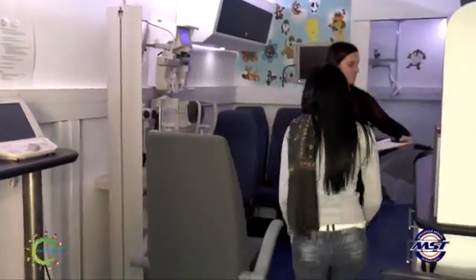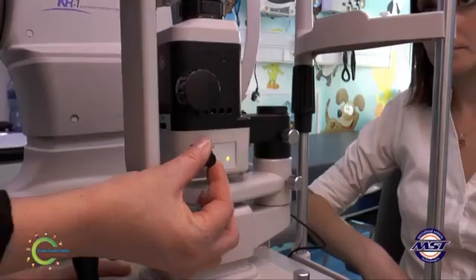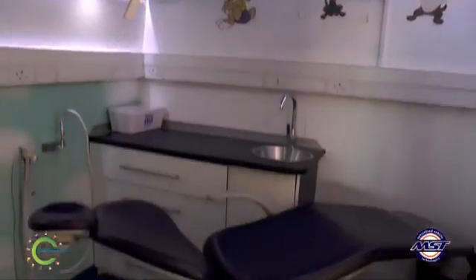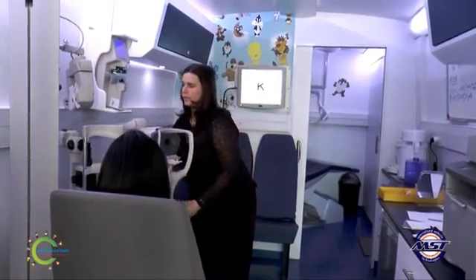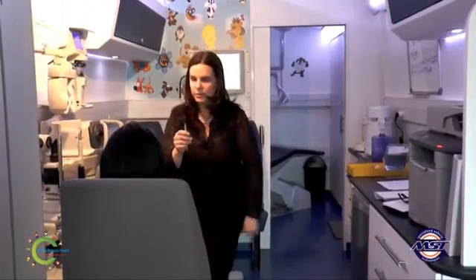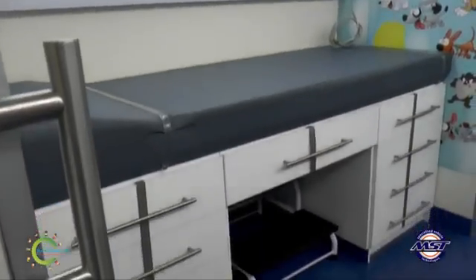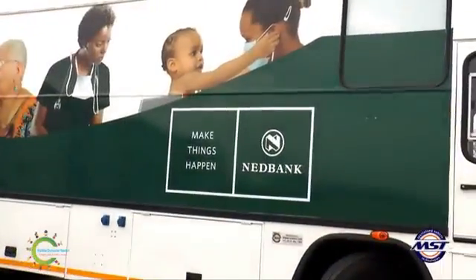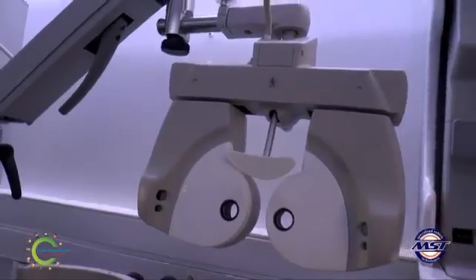This concludes the optometric portion of the Mobile Schools Health Bus. The learners will now continue to the dentistry portion or the general health portion of the bus, and the process will begin again with the next learner. At the end of the day, be sure to wipe down all equipment and to make sure all screens are switched off, as well as all equipment covers replaced.